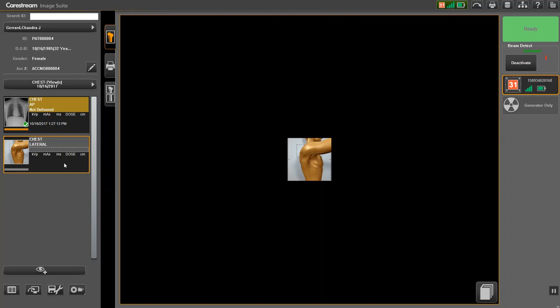You are now ready to position the patient for the next view. While you are positioning, the timer will continue to count down. If the timer counts down completely, the detector will be deactivated. Simply click on the Activate button to reactivate the detector.